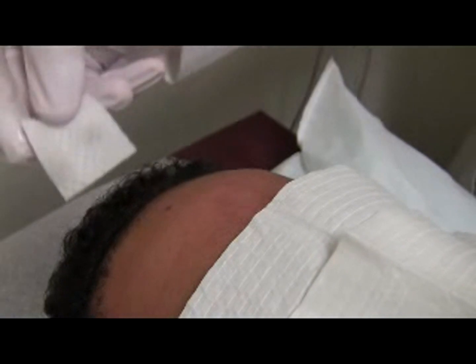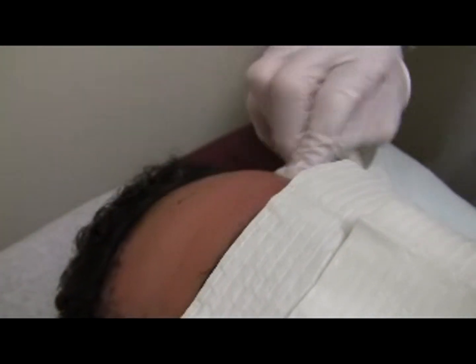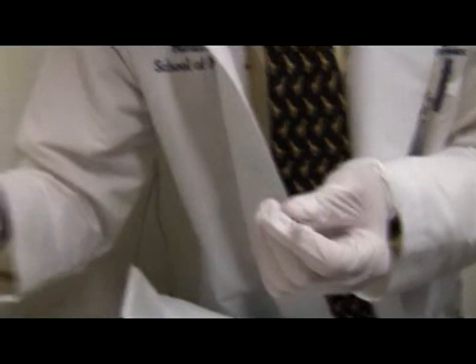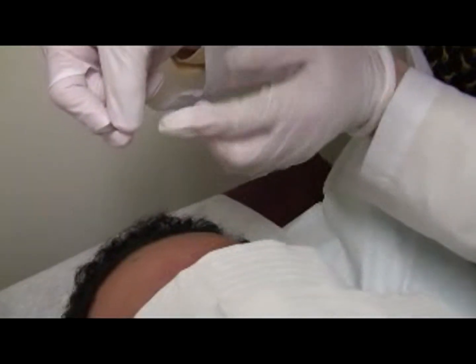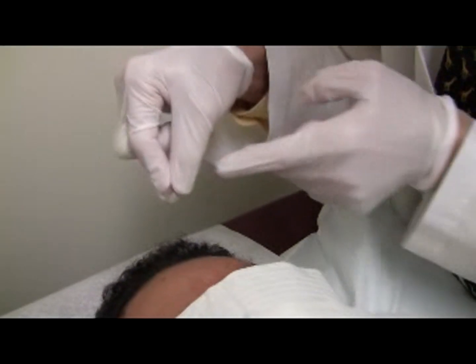Hold the 11 blade with the right thumb and index finger such that it is perpendicular to the thumb and index. Here's my thumb — focus on my fingers. This is my thumb and index finger, and I hold the blade so that the blade is perpendicular to them.